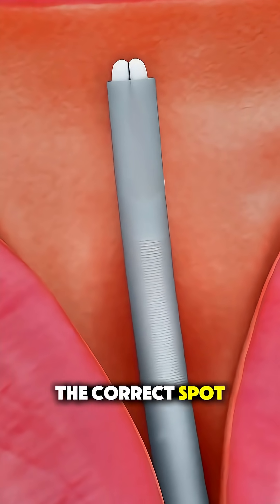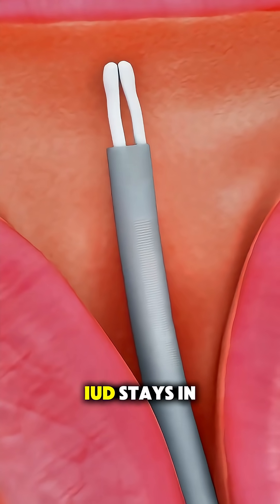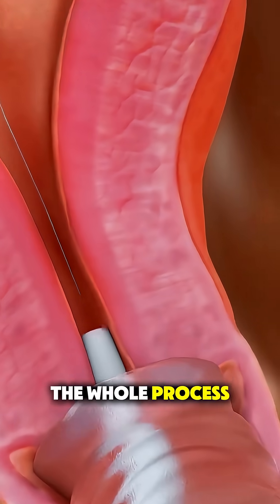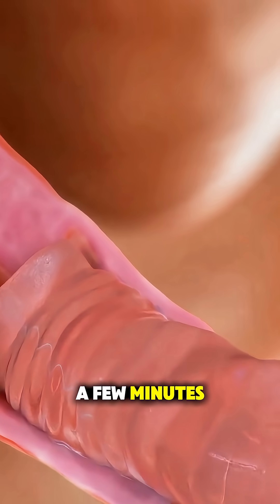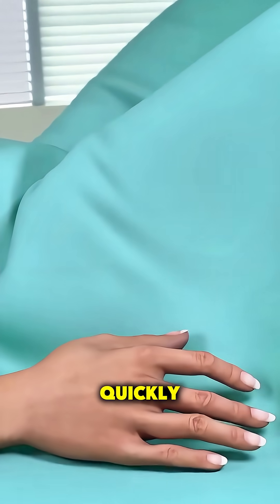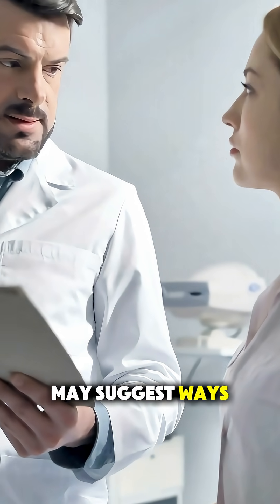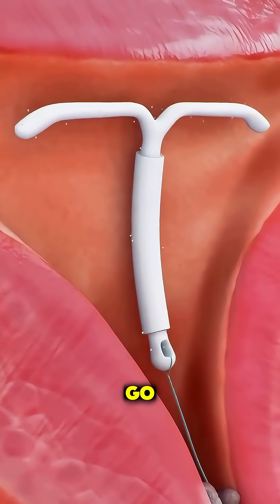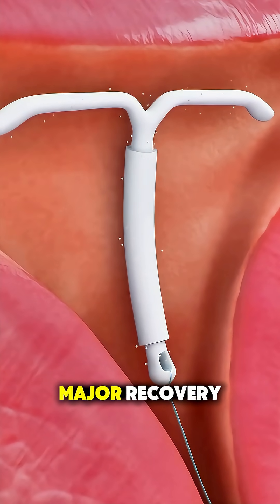Once it's in the correct spot, the guide is removed and the IUD stays in place, where it can work for years. The whole process usually takes just a few minutes. Some people feel cramping or pressure, but it passes quickly, and the provider may suggest ways to manage any discomfort afterward. Then the patient is good to go — no downtime, no major recovery.